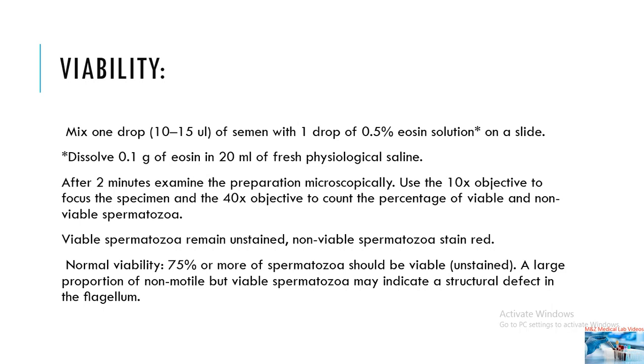Normal viability: 75% or more of spermatozoa should be viable and unstained. A large proportion of non-motile but viable spermatozoa may indicate a structural defect in the flagellum.